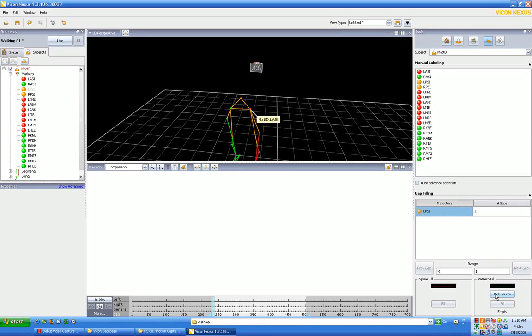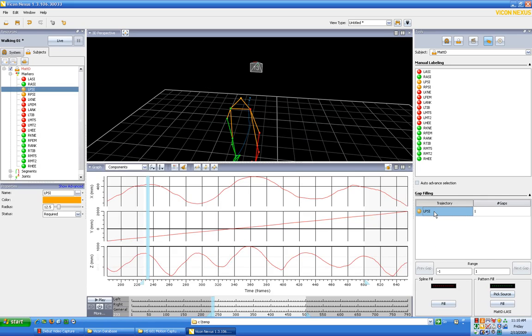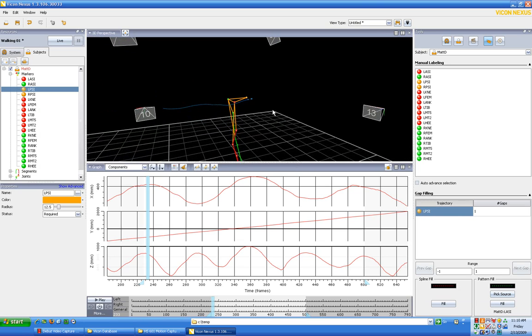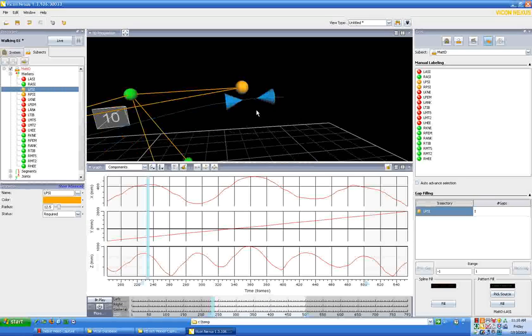What we need to do is we need to pick our source first. In this case I'm going to pick left ASI because those dots tend to move in a very similar trajectory. So if we click on this again, it's going to evaluate, if we zoom in here, what it thinks are both the spline fill and the pattern fill trajectories.